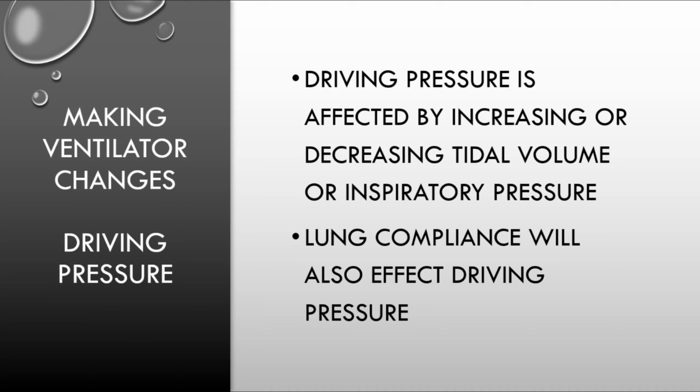If we're low, we know we have some wiggle room to go up, maybe if we're having CO2 elimination issues. And keep in mind that lung compliance is going to affect those pressure readings. If a patient has low lung compliance, their driving pressure is probably going to be high, and you're going to want to aim for lower tidal volumes.